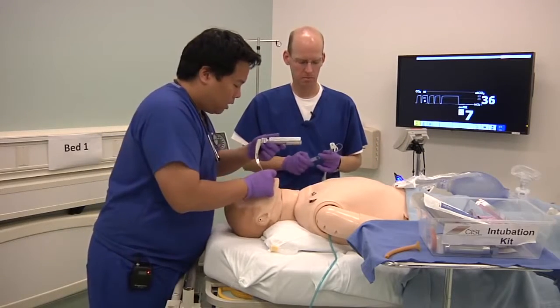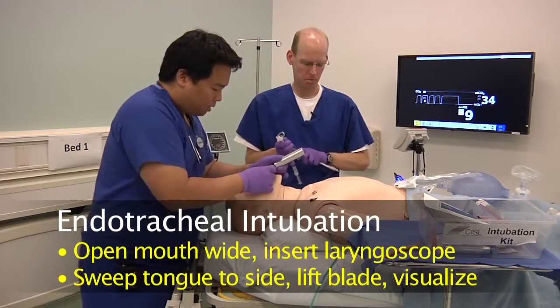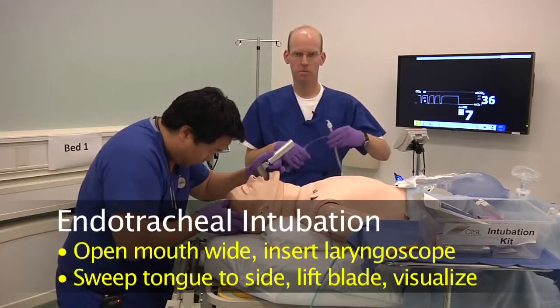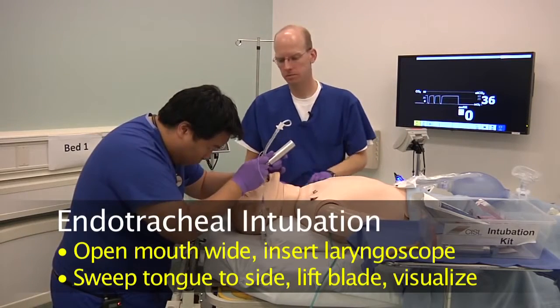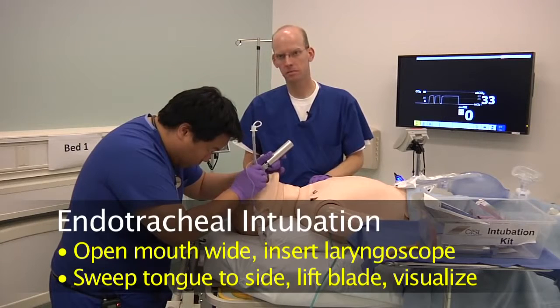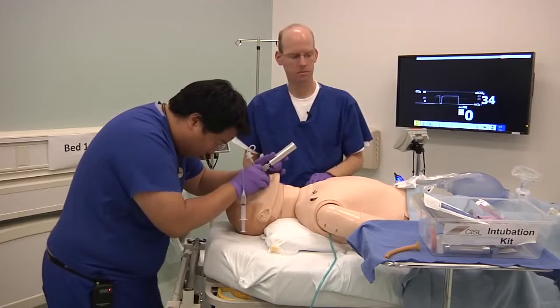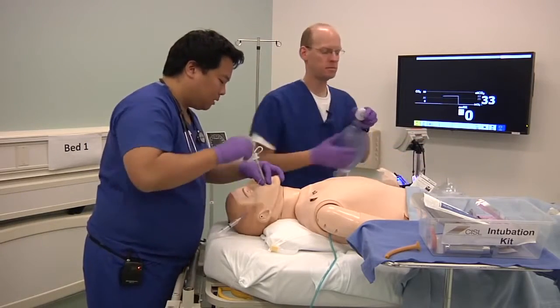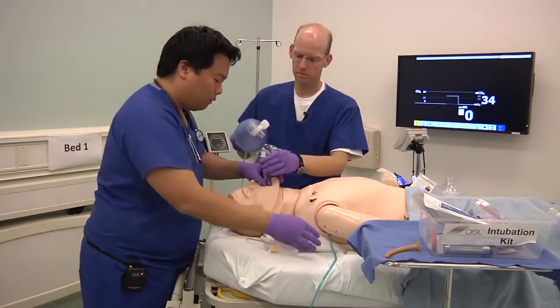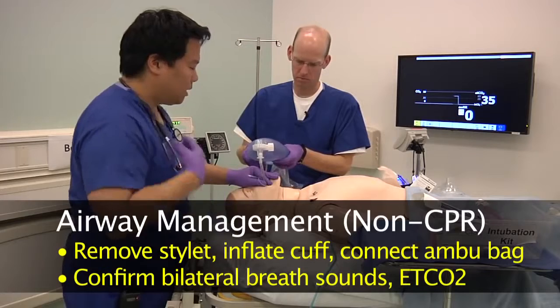The key, though, is to really open the mouth widely, start from the side, and then sweep the tongue out of the way. Tell people what you're seeing. I have a grade 1 view. And when you have the grade 1 view, don't look up to see where the tube is. Someone will hand it to you. And keep that visualization on the glottic opening. And then once that endotracheal tube is in place and the cuff is past the cords, then you can now remove the stylet. You can inflate the cuff, and you can have an assistant ventilate the lungs.